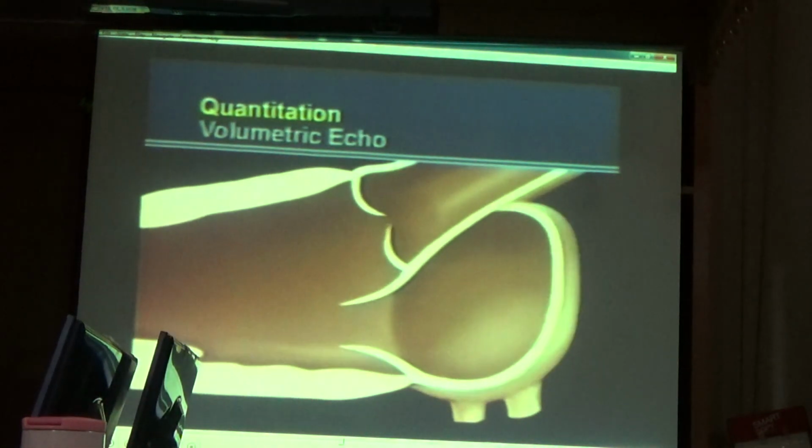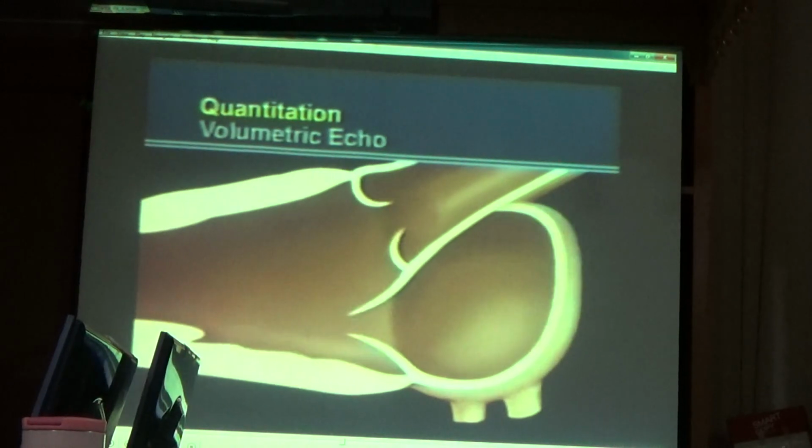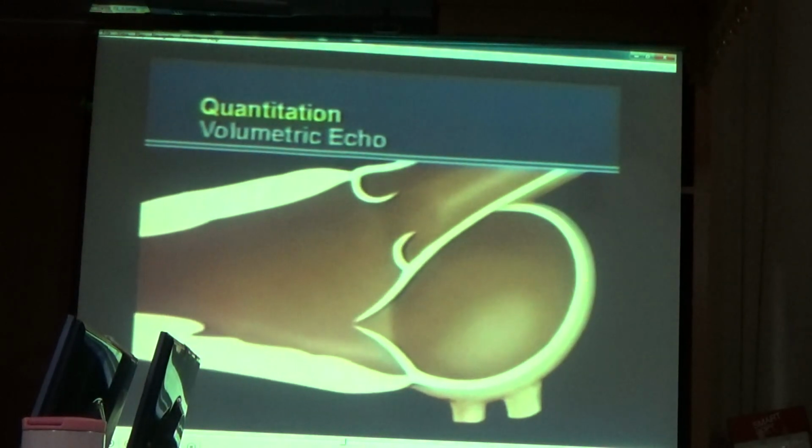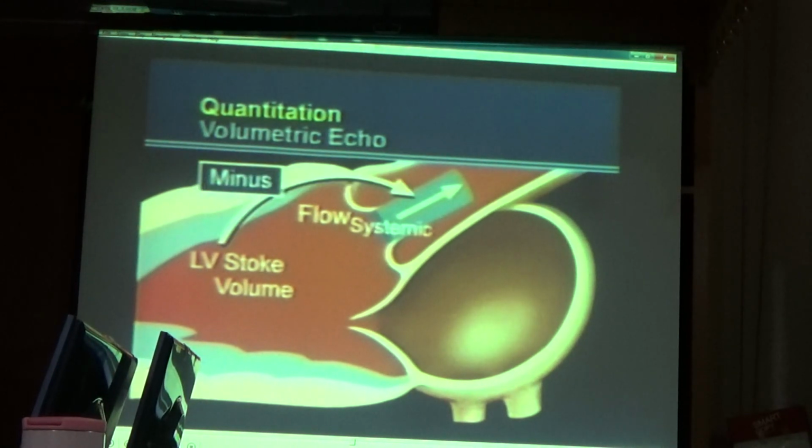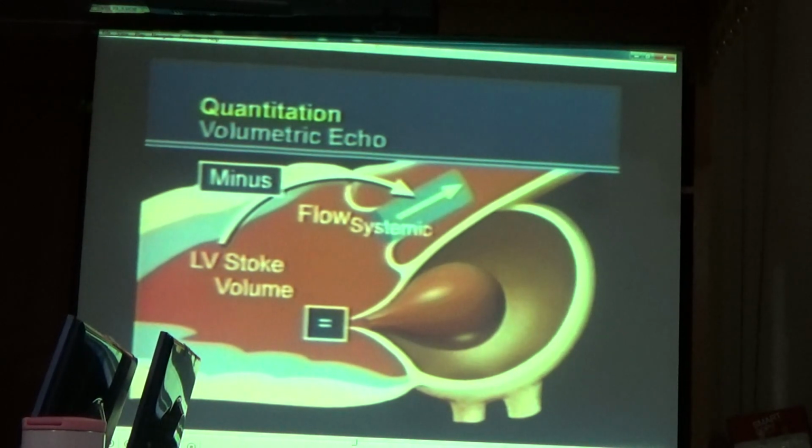Commonly, either from 4-chamber view or whatever, we can measure the volume of the ventricle, usually by the Simpson's rule, but we can calculate stroke volume by looking at diastole and systole. The stroke volume of the ventricle sends blood in regurgitation of the mitral valve into the left atrium and out the aortic valve. So we take Dr. Guru's technique, calculate cardiac output across the aortic valve, which we assume is not regurgitant, and we subtract the two, and that would equal regurgitant volume.